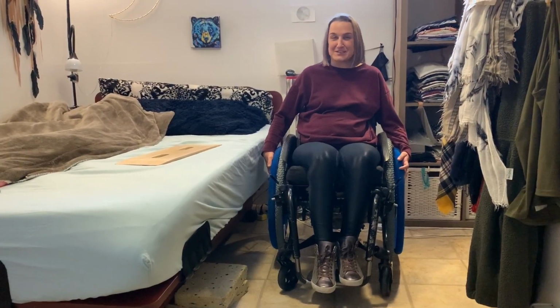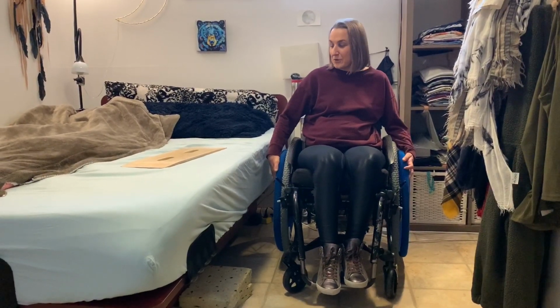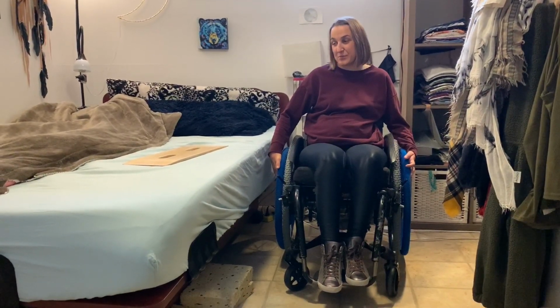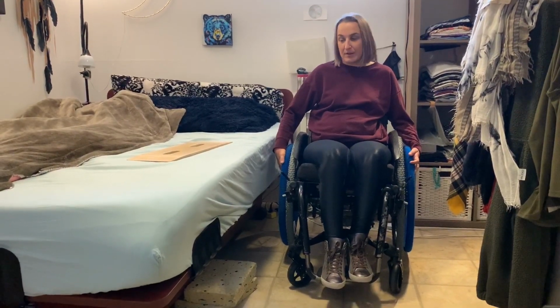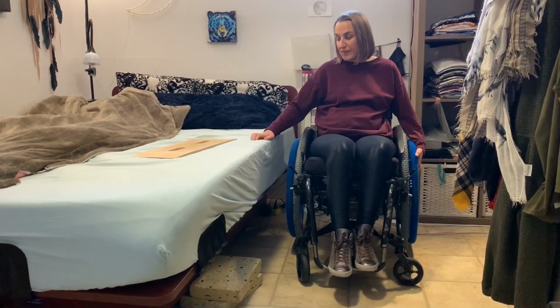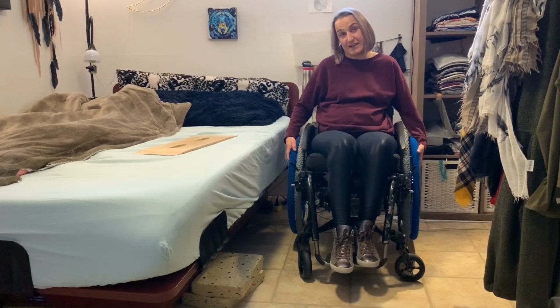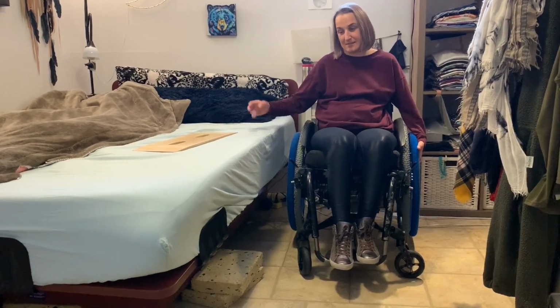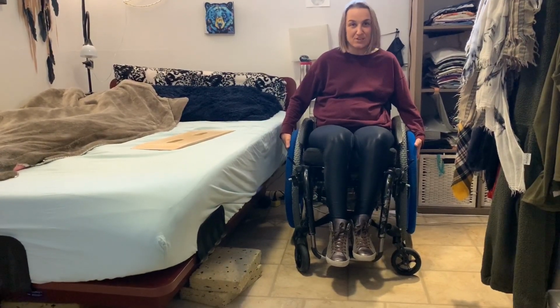I just wanted to show you how I transfer. The first thing I'm going to do is transfer with a board, and the second one will be transferring without a board. My bed is a little bit taller than my chair, so it makes the transfer a little bit harder. I'm quite tiny, so most beds are too high for me, or too low, and I can't transfer back onto my chair.